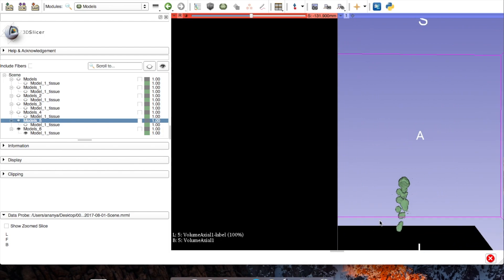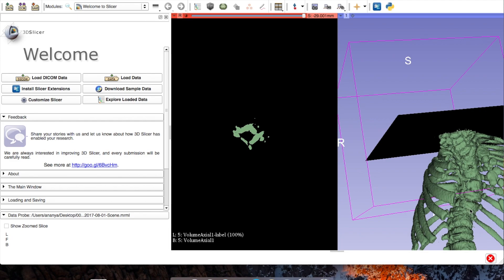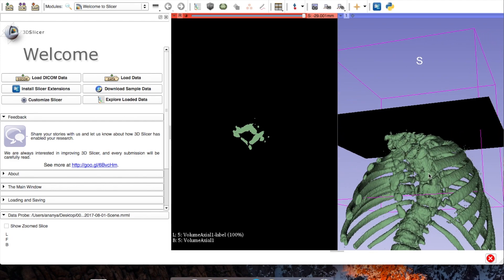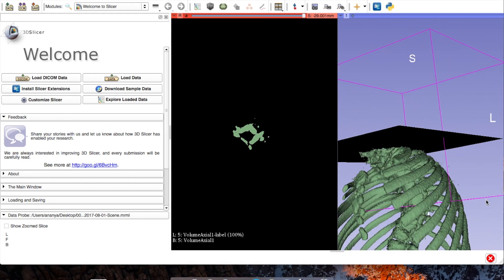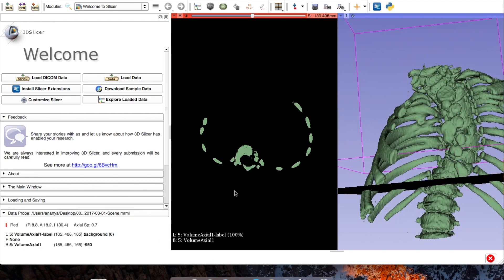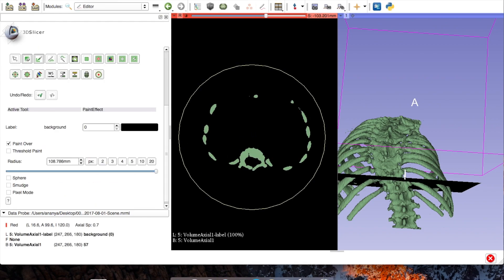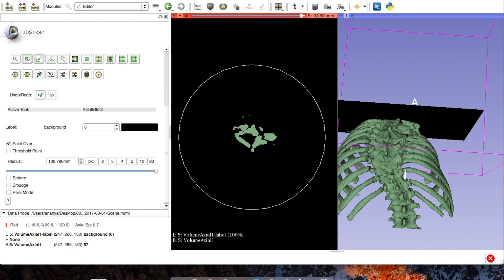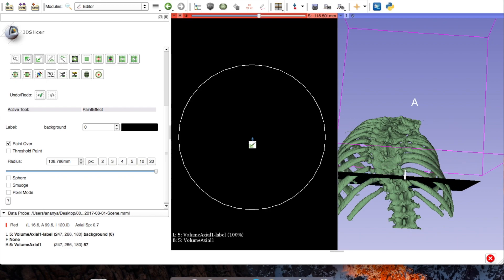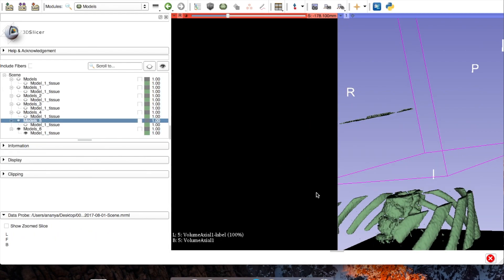Now we're going to talk about how to isolate the vertebrae, which I think is the hardest part. Many of them might be fused, so you may leave them as one column, but try to separate as much as you can. Always start with the bottommost vertebra — the one where the last ribs attach. Delete everything below that rib and everything above it, but leave some wiggle room so you don't delete too much. Make sure you include the vertebral body and the spinous process.